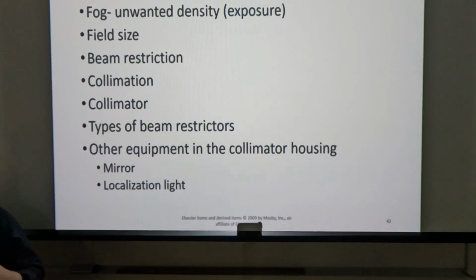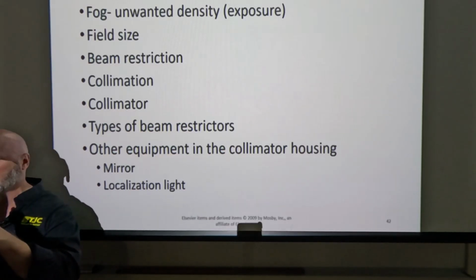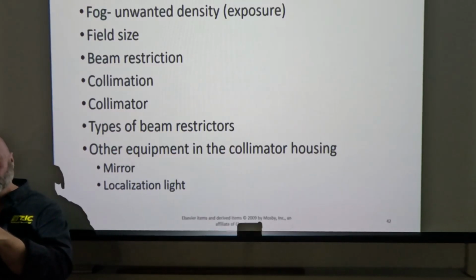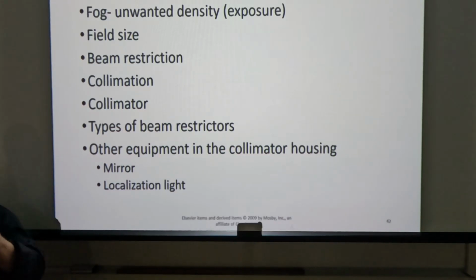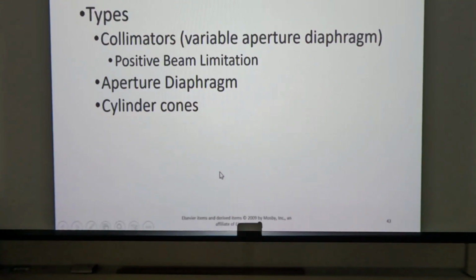They have differences, but they have similarities. So they're going to diverge at the same rate. So if our light field is way back here and our focal point is here, then you have dissimilarity between those two things, right? So same distance, perfect 45-degree angle, and then of course we've got the increase in inherent filtration as well. All right, so we just talked about all those.